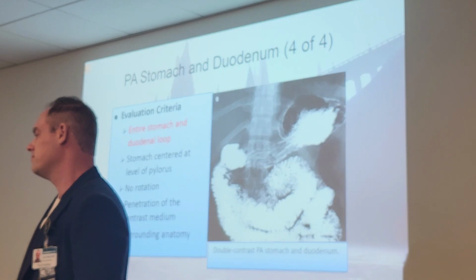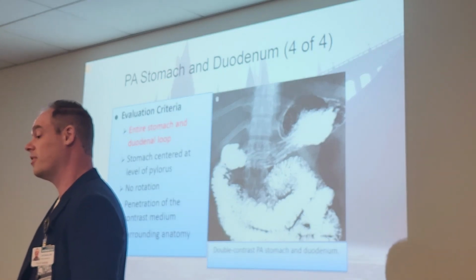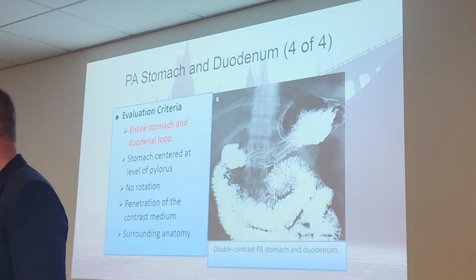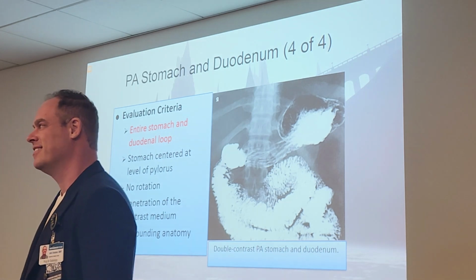You have to open it up a little bit. Pretty much. The SID? You increase it. No, you just have to get it all in one shot. Oh, you're right. So you have to just miss it with this patient and try to open up. Yep. No mercy.